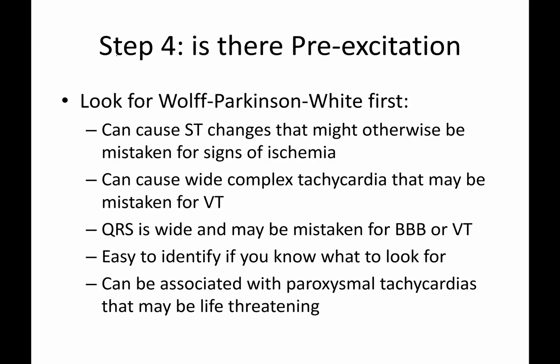Right, and so welcome to step 4 of 12 lead EKG interpretation. So, what are we talking about in this section? Well, we're going to talk about pre-excitation, which is also known as re-entrant rhythms. And one of the more classic ones that a lot of people have heard of is Wolff-Parkinson-White, which is abbreviated as WPW. And the idea is this.